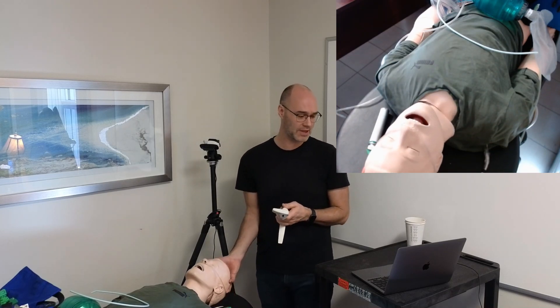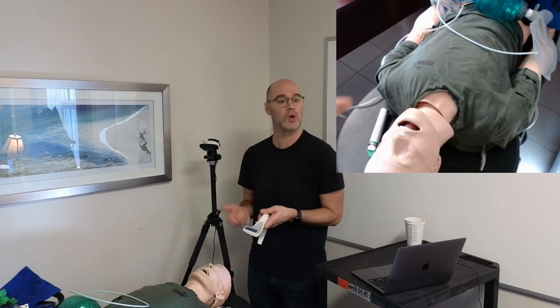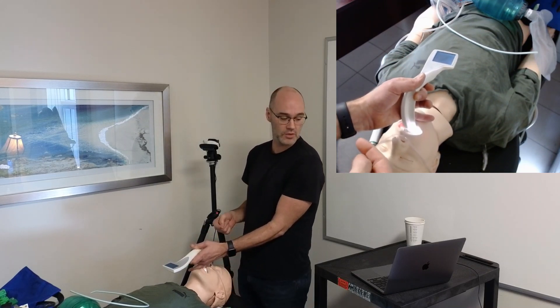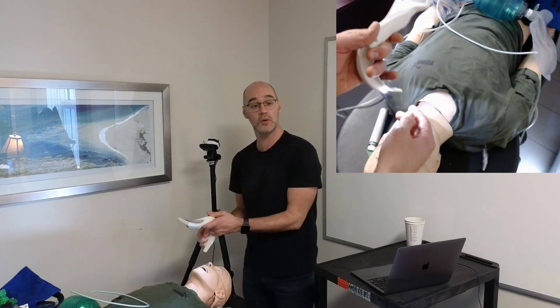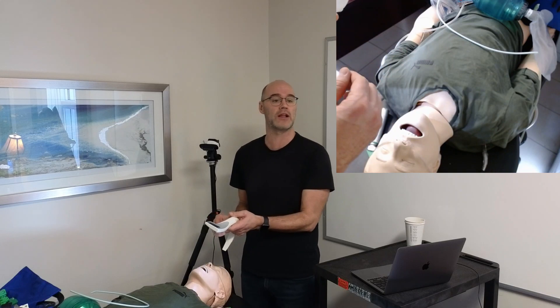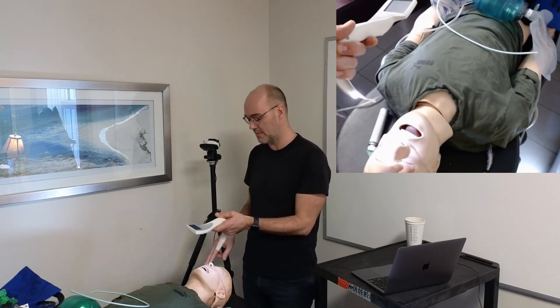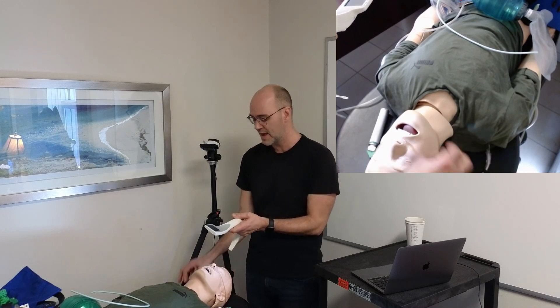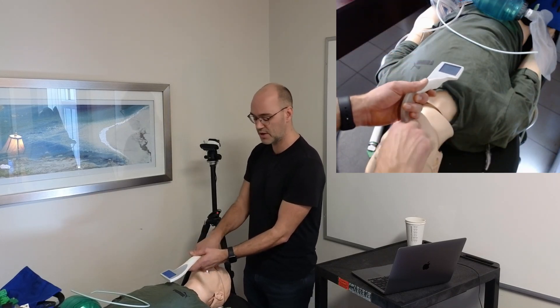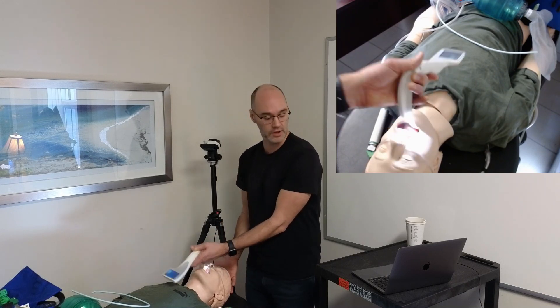When inserting the blade into the patient's mouth, tip their head back — this causes the mouth to open and makes it easy to align the oropharyngeal airway as you insert the blade. You can use a scissor technique with your fingers or push your fingers apart to open the mouth, making sure no lip is caught under the teeth. We don't want to cause any trauma to the lips during insertion.